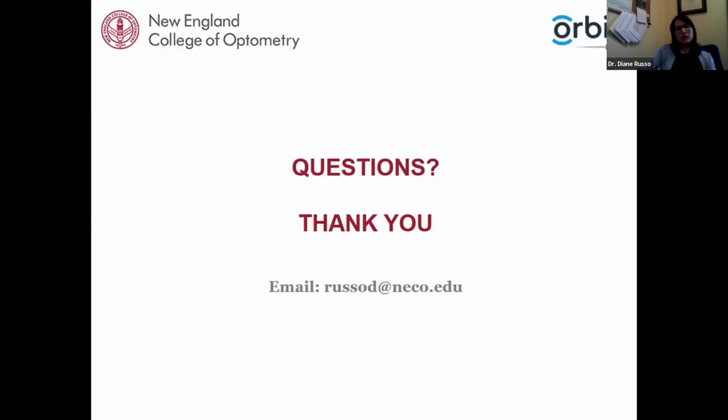So if your patient has cataracts or some type of other opacification, you should be able to see some of that while you're doing retinoscopy, or even if you decide to skip forward and do direct ophthalmoscopy. If there's a very dull glow, yes, it certainly could be because there is a cataract there. And again, that's something that you may be able to detect before you even start the refractive findings.